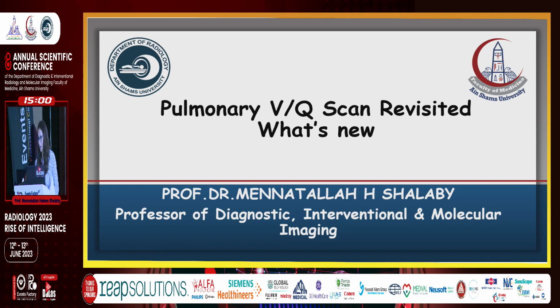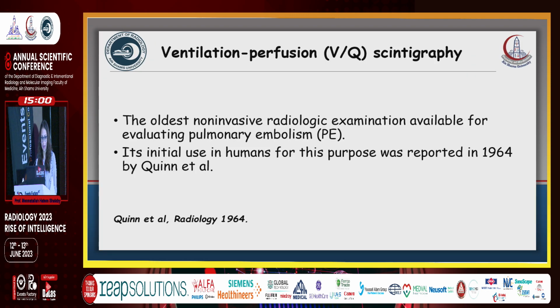Good morning, everybody. My talk today will be a brief talk about pulmonary VQ scan, its new applications, just to draw attention that conventional nuclear imaging still has a role. Not only PET-CT is taking over, but still there are new applications for the pulmonary VQ scan. As you all know, VQ scan is the oldest non-invasive radiologic examination available for evaluating pulmonary embolism. It was initially used in humans in 1964.